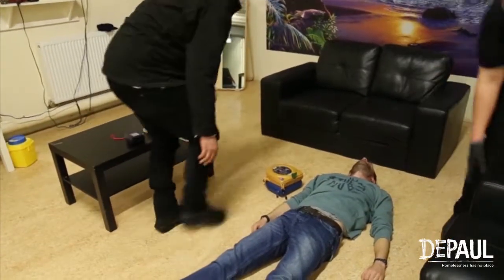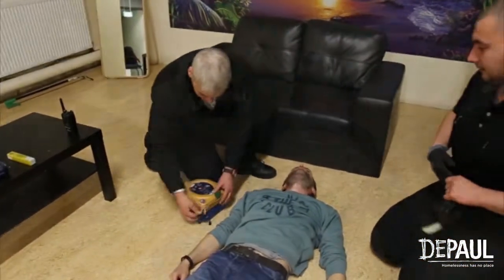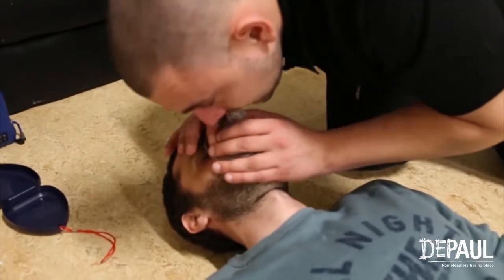When a person is not breathing and requires CPR, the AED is needed. One person should open and turn on the AED and attach the pads as soon as it arrives on the scene, while the other person is checking for breathing, giving breaths or starting compressions.